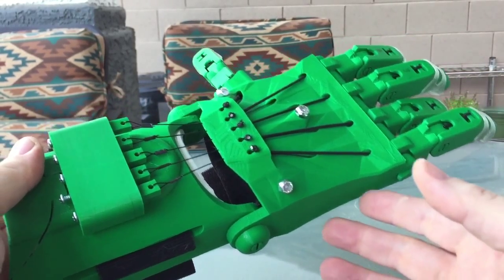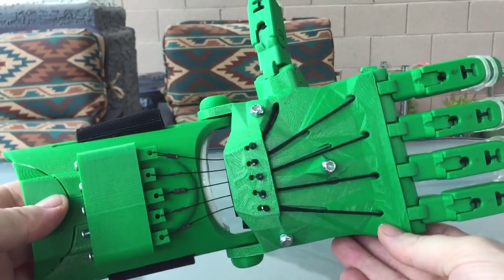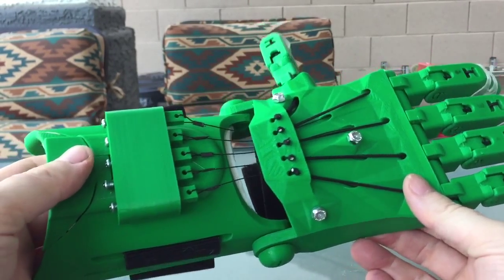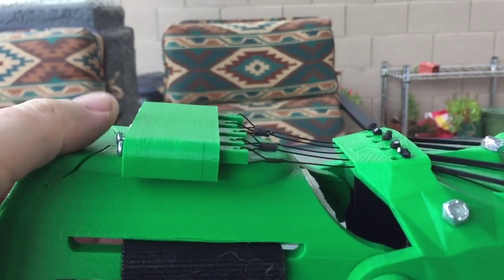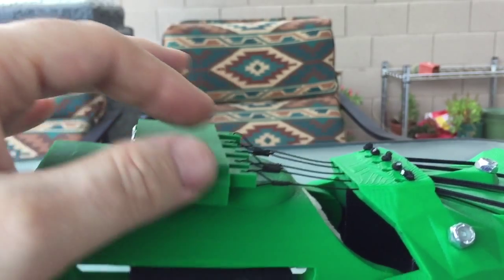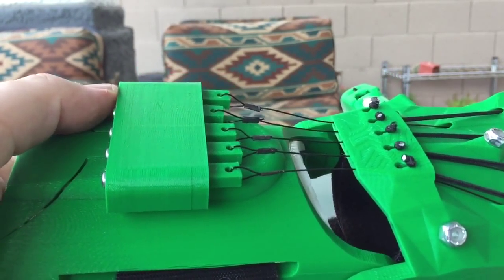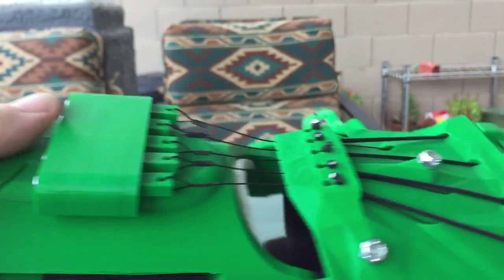Here's the final version of the Raptor prosthetic hand. I made a couple of accommodations, a few little changes. The original design had Kevlar fishing line tied up here, but I was too lame to tie it off consistently and I had a real problem getting the tension right across all the tendons here.